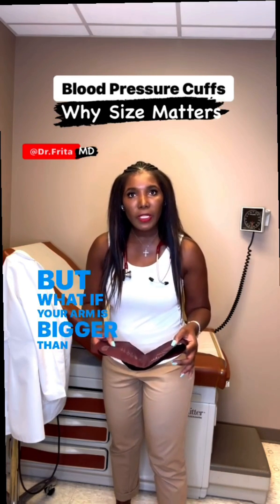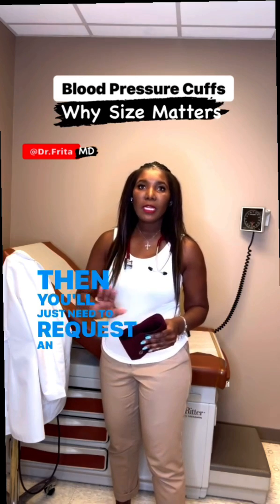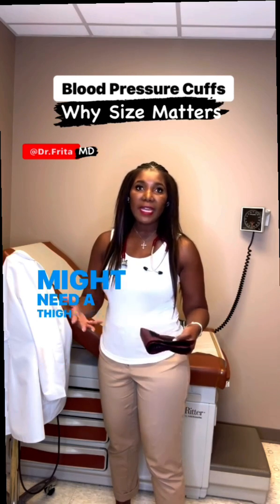What if your arm is bigger than that? That's okay — then you'll just need to request an extra large cuff, or you might need a thigh cuff.